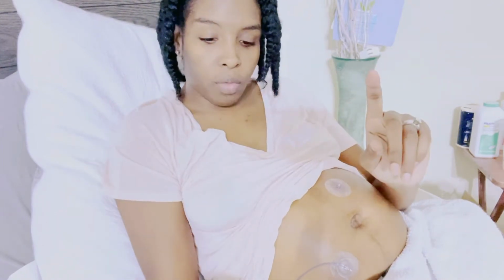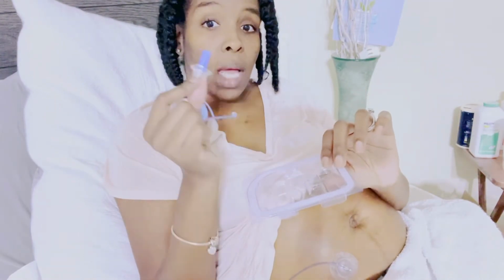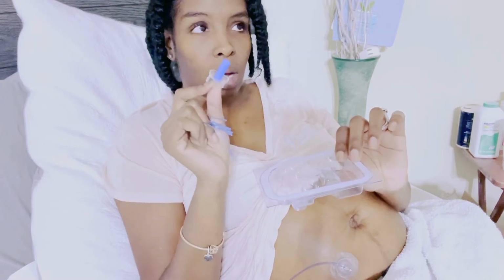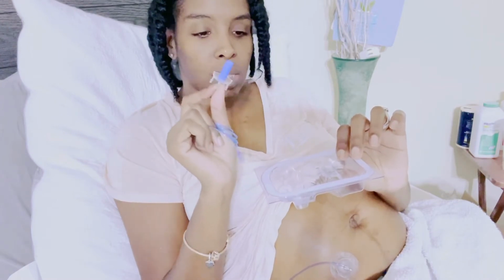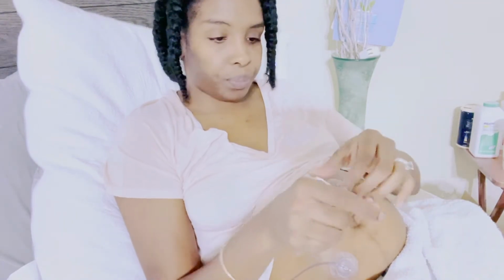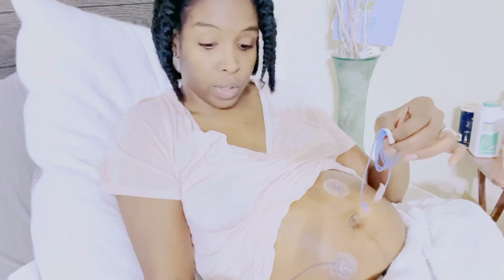So you put this little blue cap on it. Now for the video purposes, I put this in here, but this is the piece that you're definitely going to put into your needles bin. You're going to throw this into the needles bin so that when you dispose of this stuff, wherever you take it, this is not sticking other people, passing diseases, or getting someone's blood contaminated if they come in contact with your needle.